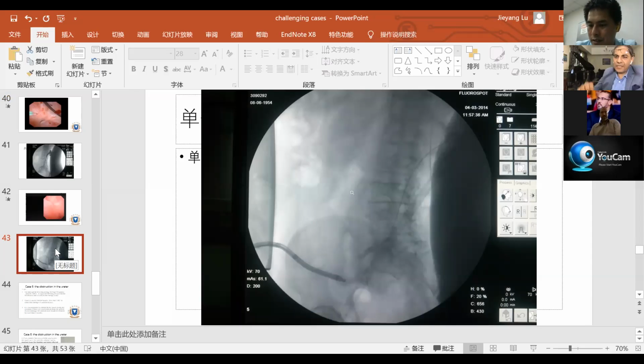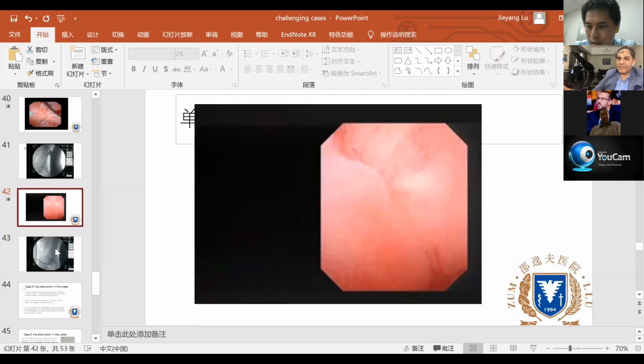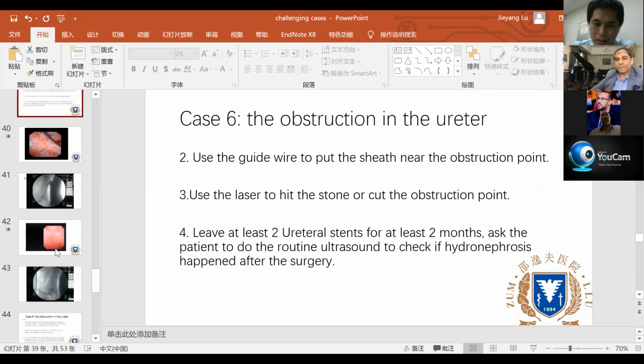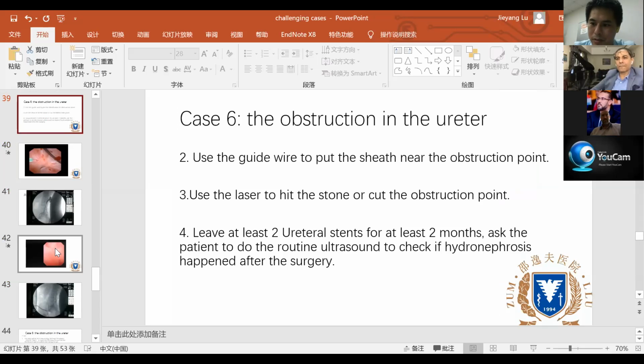Okay. My question is about the ureteropelvic junction, UPJ. All of us know that UPJ obstruction is not a mechanical obstruction. It's a functional obstruction, a dynamic segment. So pyeloplasty is the ideal choice for such cases, and all the literature shows the high efficacy of pyeloplasty, either open or laparoscopic, over endoscopic management. We reserve endoscopic management for secondary cases of UPJ, not for primary cases. Is this the same indication in your hospital? Yes, when we meet UPJ obstructions, we first consider open or laparoscopic surgery. Okay. So this laser technique is mostly for secondary or recurrent cases. Second option. That's perfect.